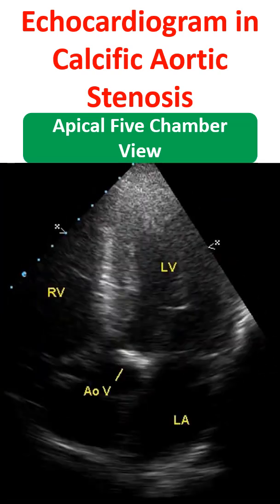Still frame from apical 5-chamber view showing four cardiac chambers and the aorta with calcified aortic valve. The interventricular septum can be seen thickened as part of the left ventricular hypertrophy.